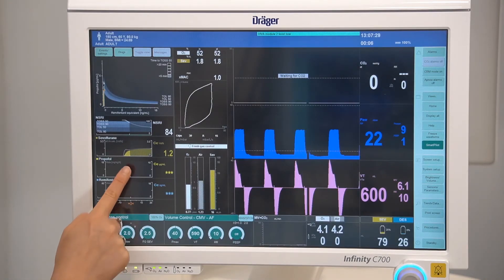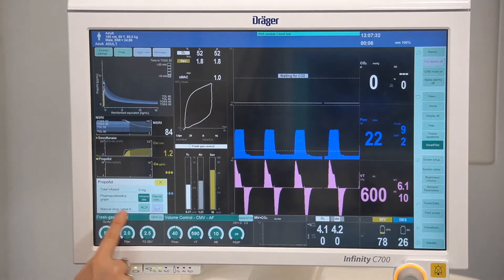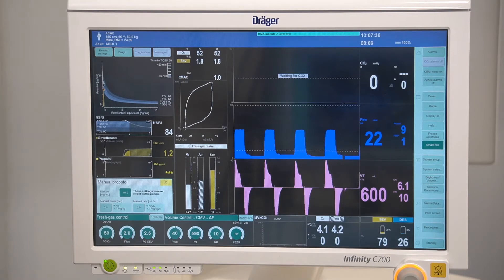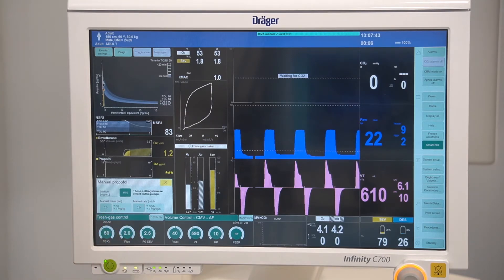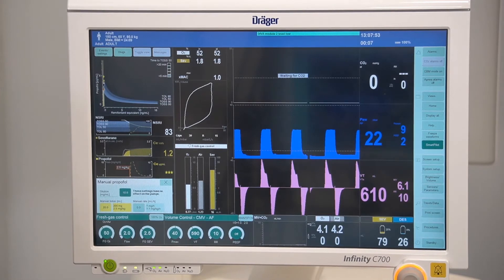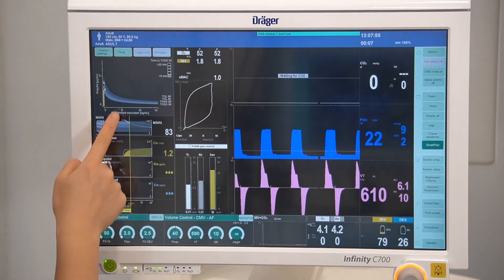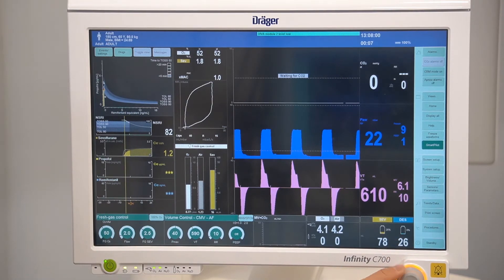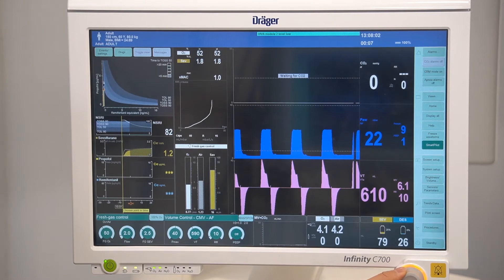To deselect a drug, touch the drug. To select a drug, touch the desired drug. To enter a manual dose, this can be done by touching on the parameter box, then touching the syringe icon, which will then allow you to enter either a manual bolus or a manual rate. Touch, turn, and confirm.